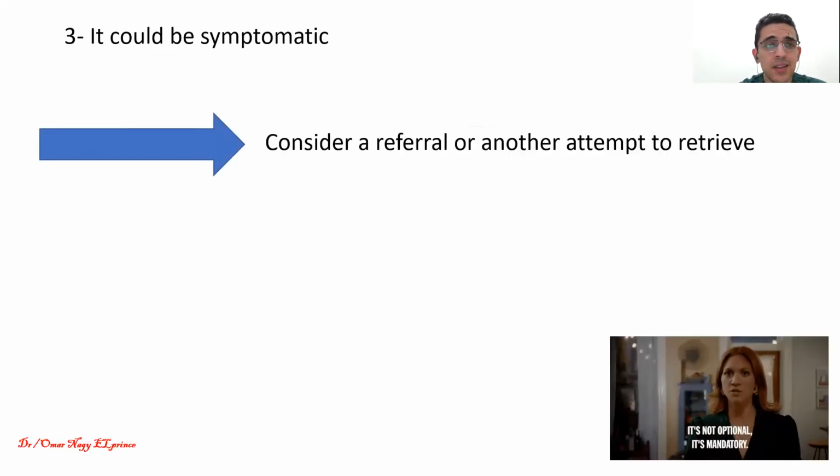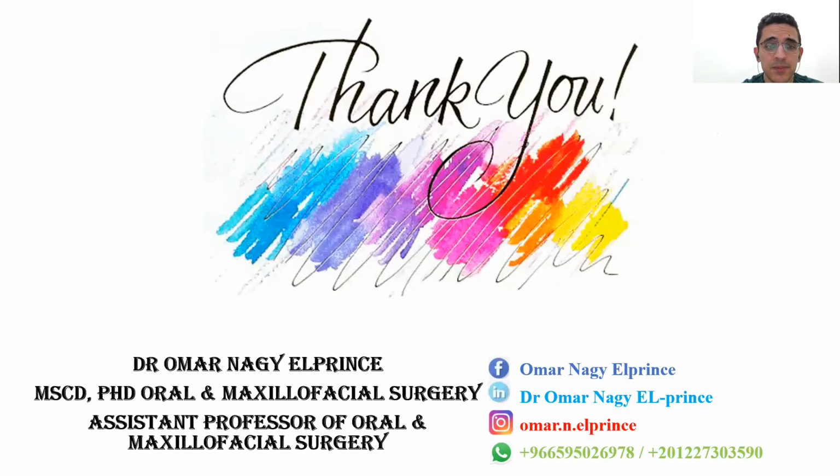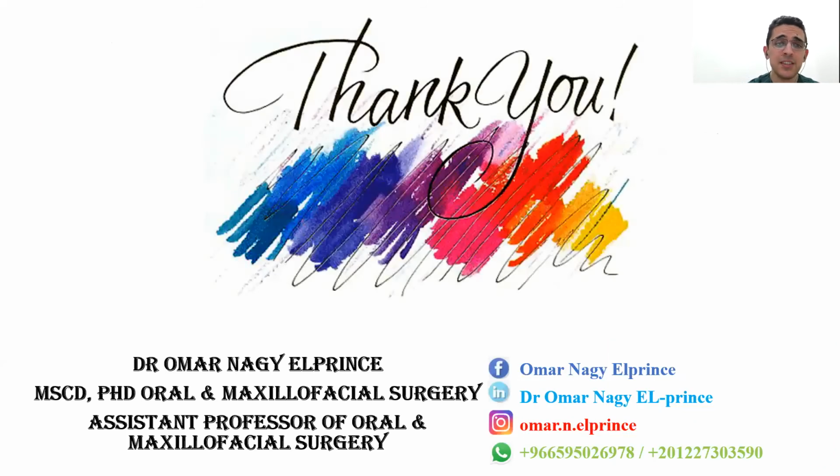The third feature is that it causes symptoms like sinusitis, blockage of the nose, nasal drip, or oroantral communication. In this case it is mandatory, it is not optional, to remove your implant. Either you refer to an oral maxillofacial surgeon or you try another attempt to retrieve the implant. So that's all.